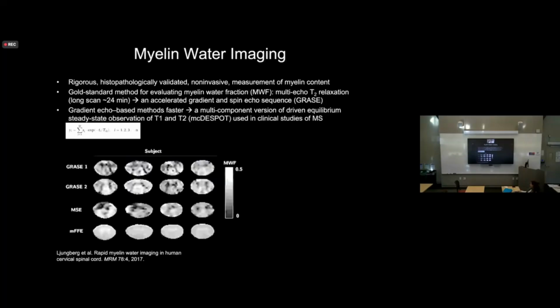So now we're talking about myelin sensitive. We're talking about macromolecular involvement or macromolecular content. So we typically think about that in the central nervous system as being largely driven by myelin. I won't belabor why we think it's mostly myelin, but a lot of the exchange phenomenon that goes on, the relaxation phenomenons that go on, driven largely by myelin in the central nervous system.